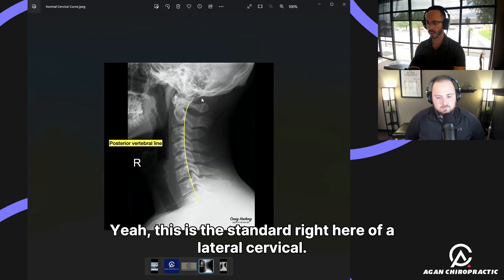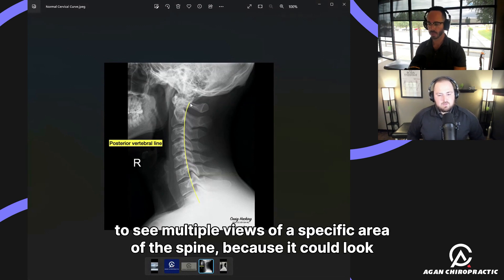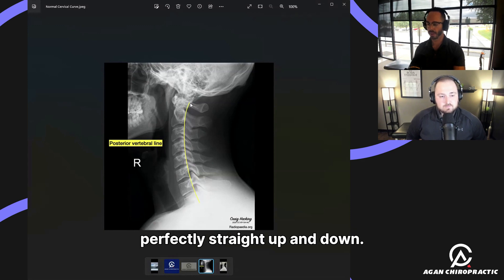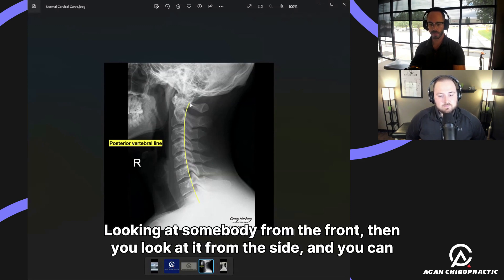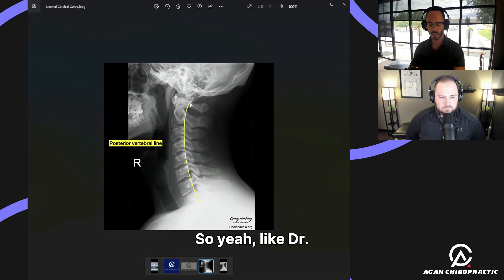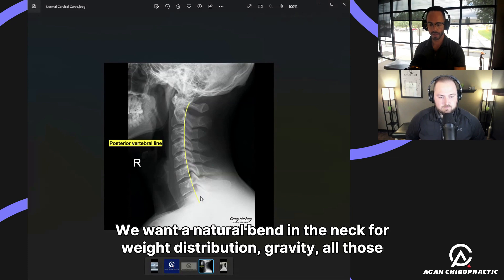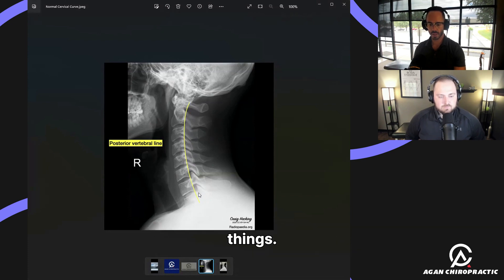This is the standard lateral cervical X-ray, looking at a patient from the side. We often want to see multiple views of a specific area of the spine because it could look perfectly straight from the front, then from the side you can see what we call reversal of the curve. This is textbook normal — we want a natural bend in the neck for weight distribution and gravity.